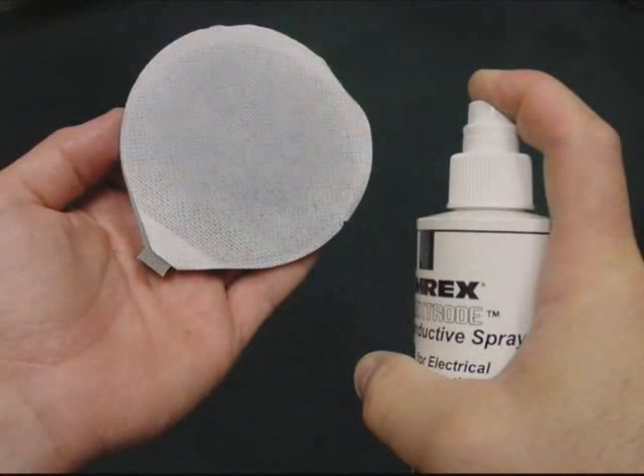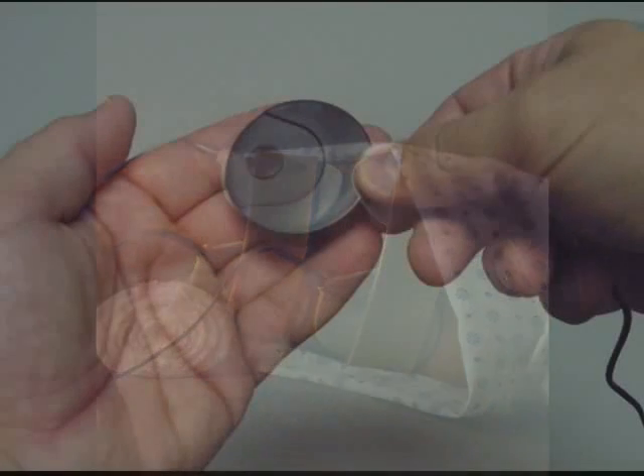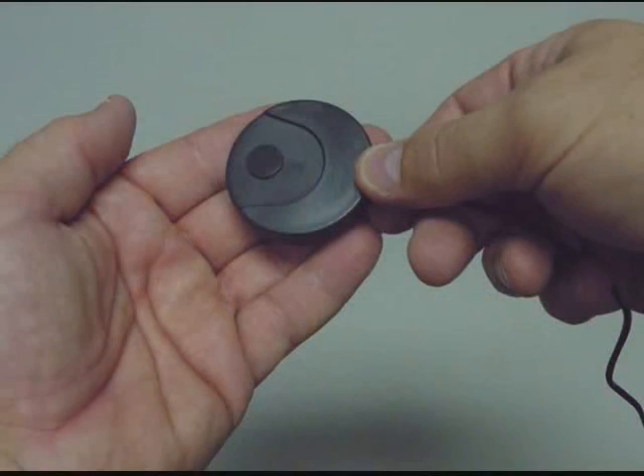Prepare the pad electrodes and apply them to the patient. They may be held in place using retention straps or weight bags. Hand the treatment stop switch to the patient and explain its function.